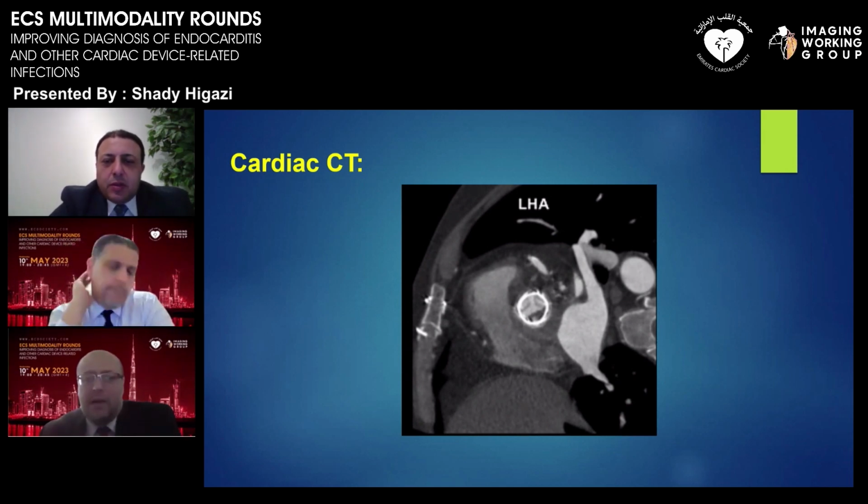That's why we like to do a non-contrast scan specifically to look for calcification, because if this valve is 10 years old, this could be degenerated. But if it's not a 10-year-old valve, then this is most likely endocarditis. With the abscess around it, if you're hesitant, the patient is heading for surgery, and surgeons like to gather more information, and this is a very extensive infection.